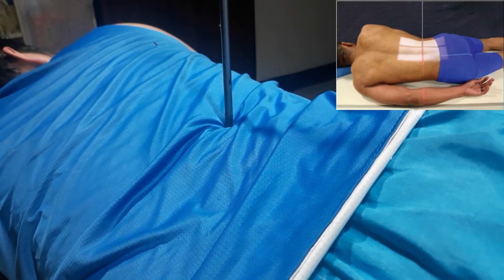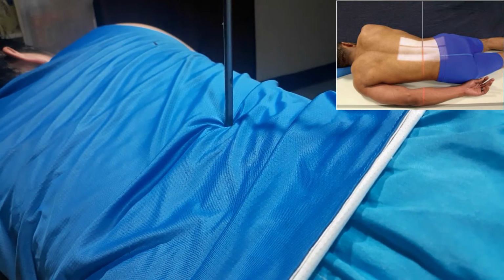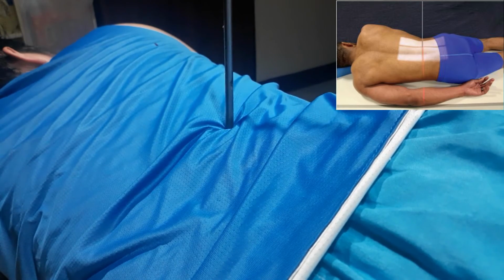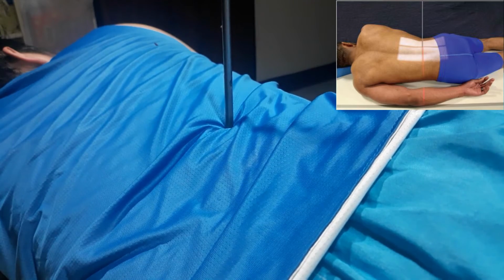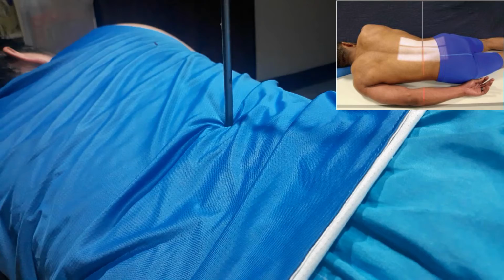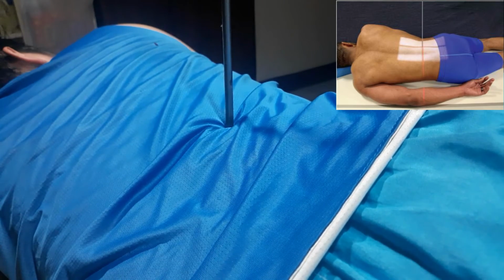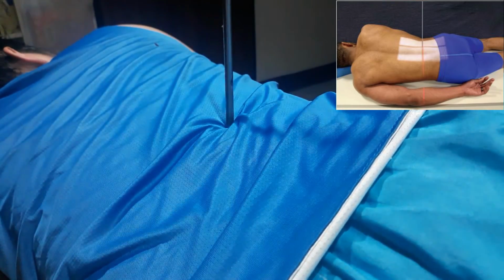For the lumbar region, have the central ray positioned perpendicularly to enter L3, that is 1 to 1.5 inches or 2.5 to 3.8 centimeters above the crest of the ilium. The central ray enters the elevated side approximately 2 inches or 5 centimeters lateral to the palpable spinous process.